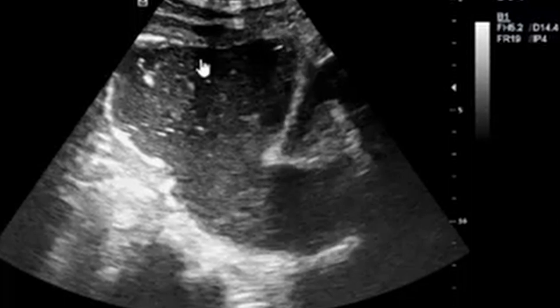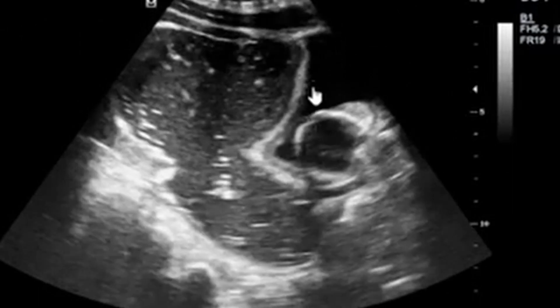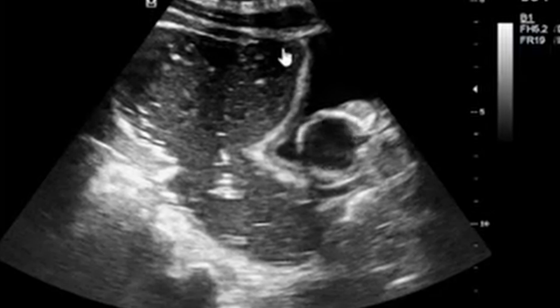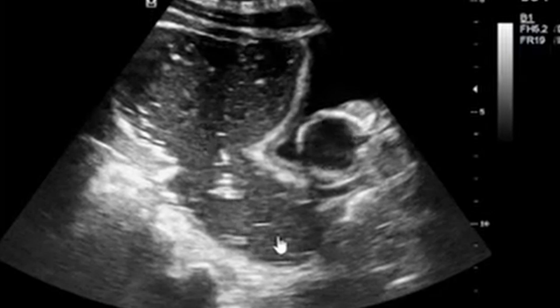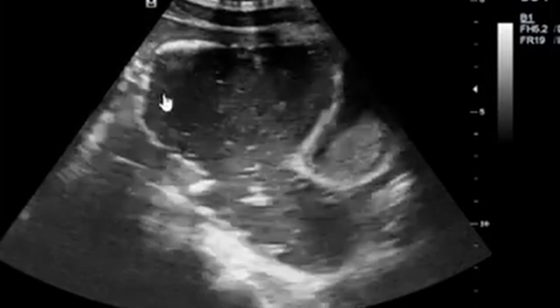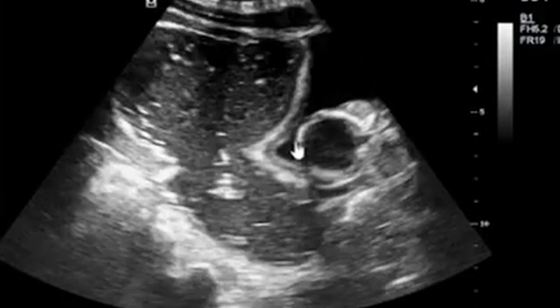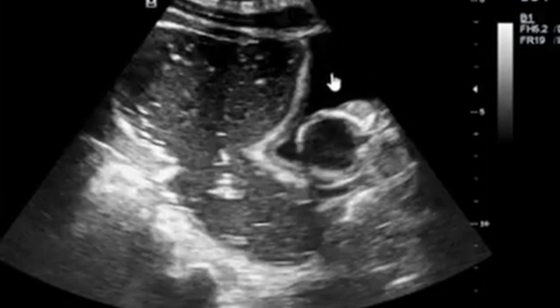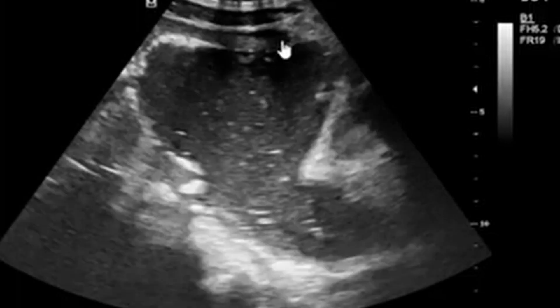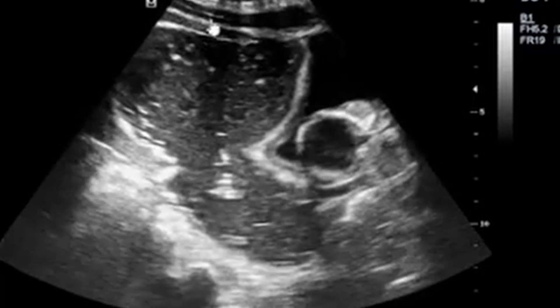You can see this is a time bomb — a fluid-filled rectum. You can appreciate the bladder here. Our rectum is contaminated with diarrhea; it is filled with diarrhea.